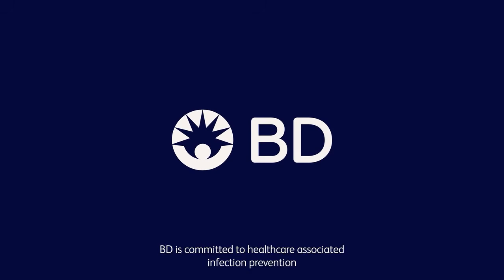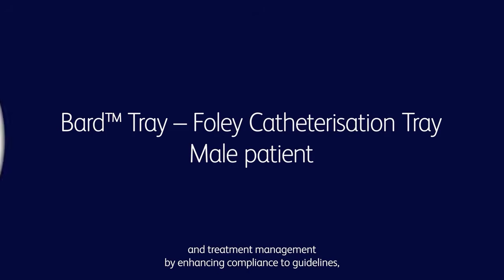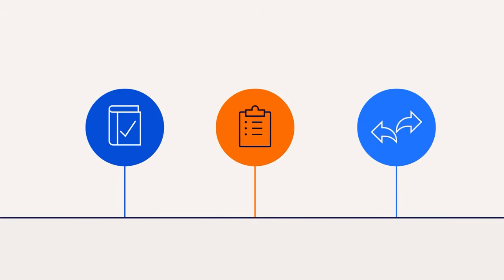BD is committed to healthcare-associated infection prevention and treatment management by enhancing compliance to guidelines, promoting standardization, and offering alternatives.